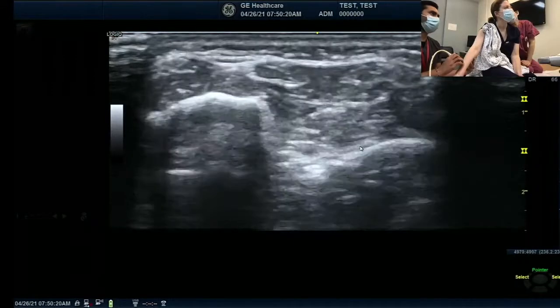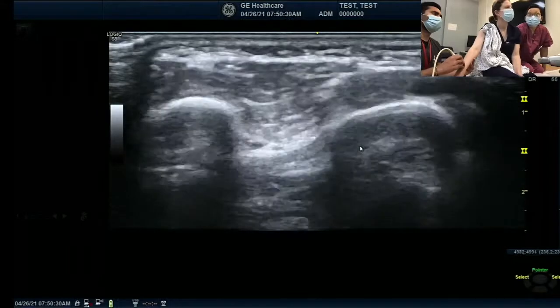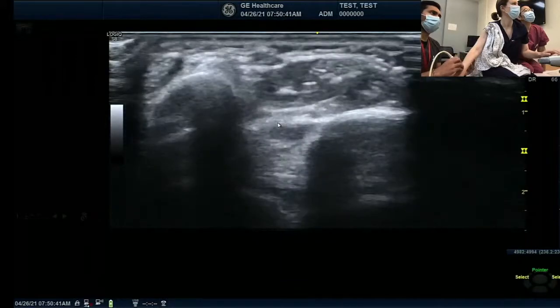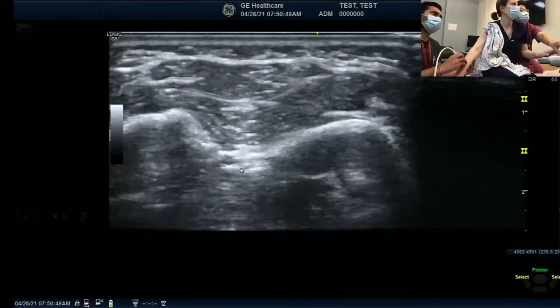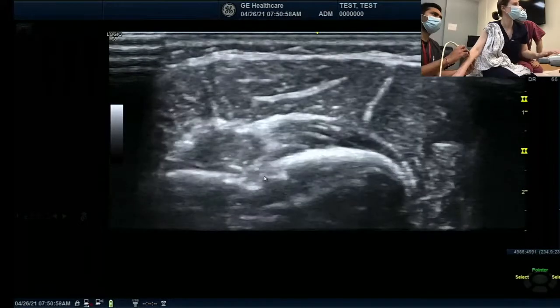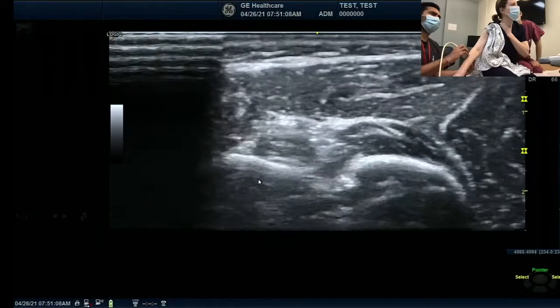Do you have any questions about the scanning today? Once again, for the sports medicine doctors, maybe the spiral groove. When you have an accident, you can have a fracture in the spiral groove. Go up and down here. Over here. You can see the supinator popping out, the radial nerve. Now you can just dream about the radial nerve while you're sleeping.